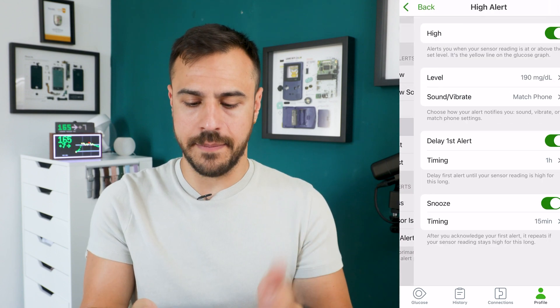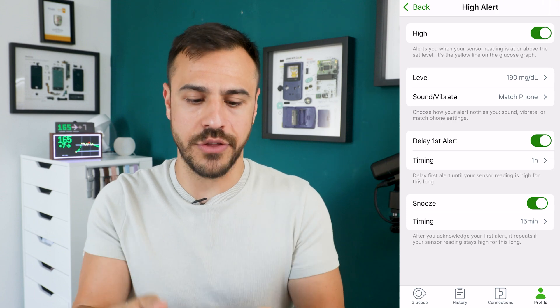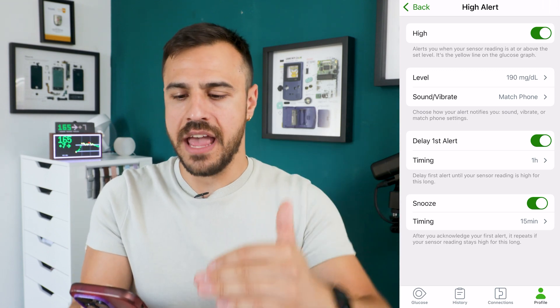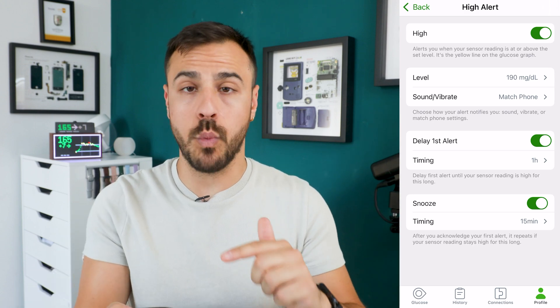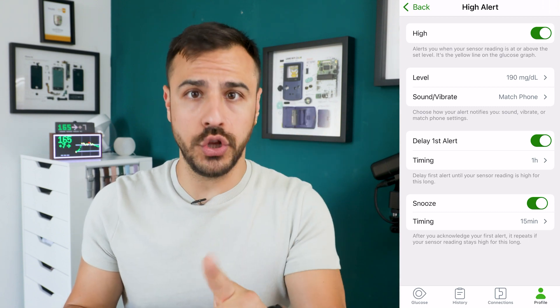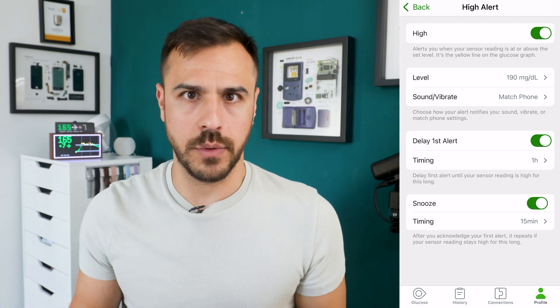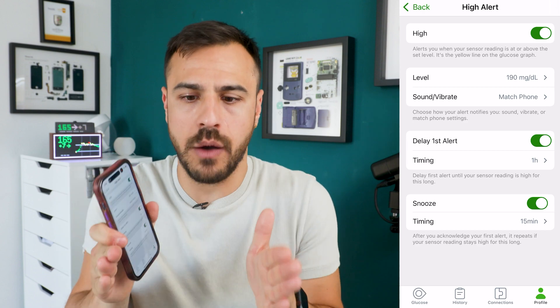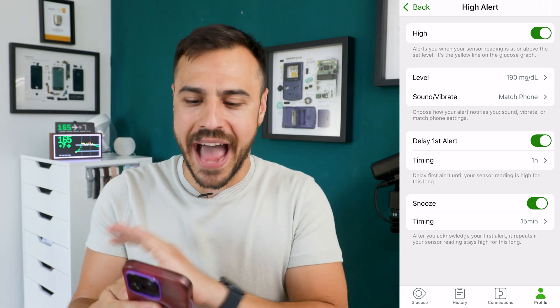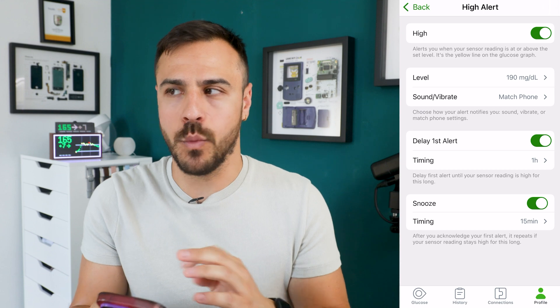When you go into highs, highs also has that snooze delay — I have that at 15 minutes as well. High alerts also introduces another feature: delay first alert. I love this one. My level for highs is currently 190, and I have it set so that I won't get the first alert letting me know I've hit 190 or above until I've been over 190 for one hour. So if within one hour I go over 190 but then drop under 190, I'll have had no alert. This feature is probably the biggest game changer for having way less alert fatigue.